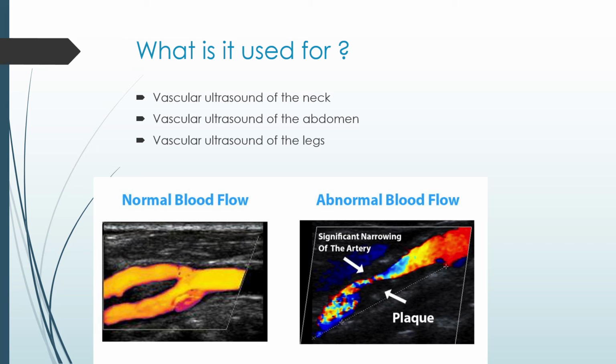Here, the duplex ultrasound of the leg arteries shows blockage that can cause leg pain with walking. And duplex ultrasound of the leg vein shows clots in the superficial and deep veins. The other name for deep vein clot is deep vein thrombosis or DVT. And vein mapping tests blood flow moving against gravity, therefore the sonographer tests the valves in the leg vein for leakage. And leaking valves is also known as venous insufficiency.